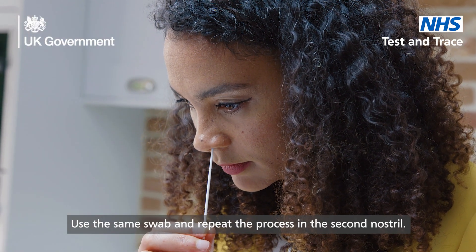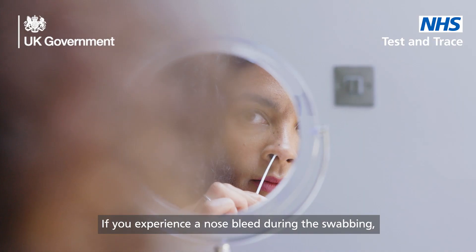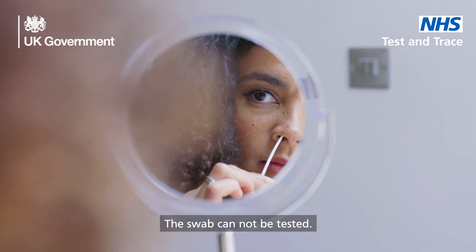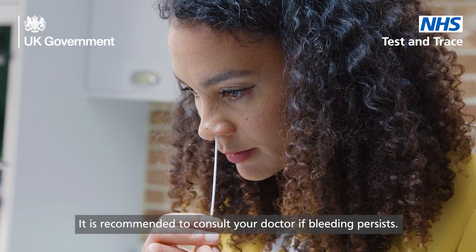No force is needed and you do not have to push far into your nostril. Second nostril: use the same swab and repeat the process in the second nostril. If you experience a nosebleed during the swabbing, please stop swabbing. The swab cannot be tested. It is recommended to consult your doctor if bleeding persists.